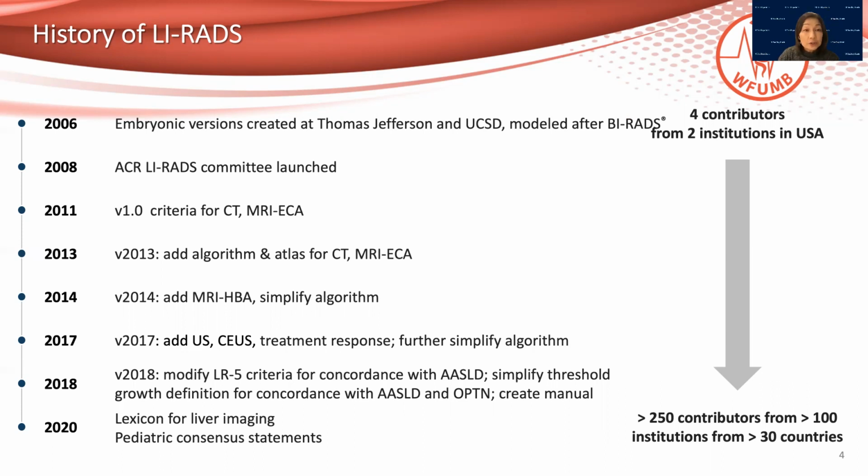The first version of CT-MRI LI-RADS was published in 2011. In 2017, ultrasound and CEUS LI-RADS were created and added to ACR LI-RADS. And in 2018, the AASLD guideline endorsed LI-RADS for HCC diagnosis. However, they only endorsed CT and MRI and did not include CEUS LI-RADS.